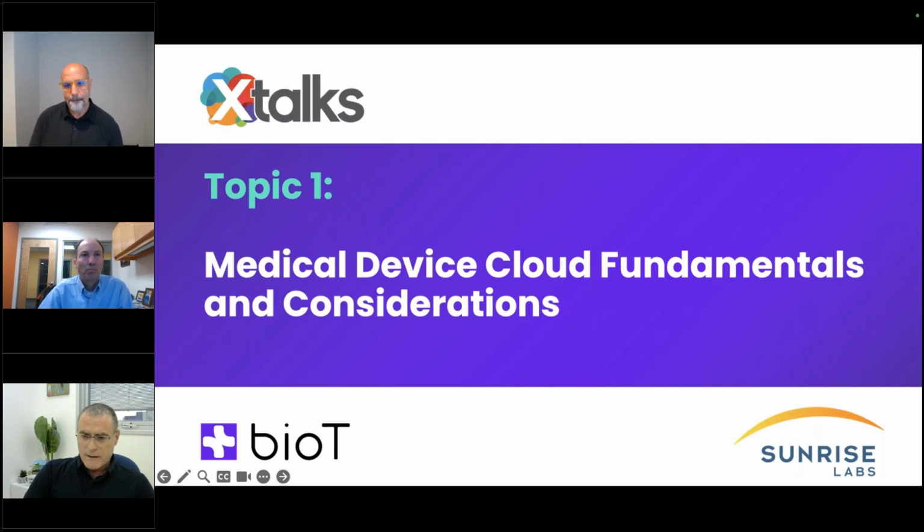One example is a company called Natera. They developed a sensor that, through radar, sits over the bed of a patient and monitors vital signs like heart rate and respiration rate. But all it does is send the raw data from the radar to the cloud, where the algorithms detecting the heart rate and respiration rate are conducted. So the device can be very cost effective and very easy to manage.